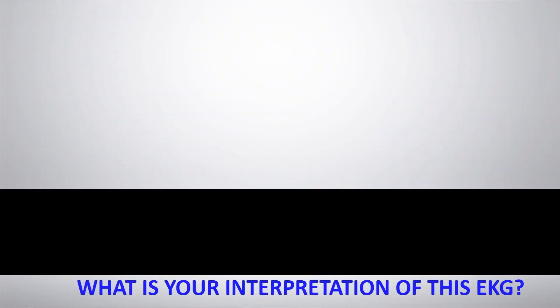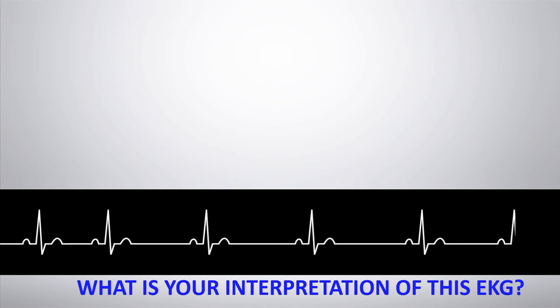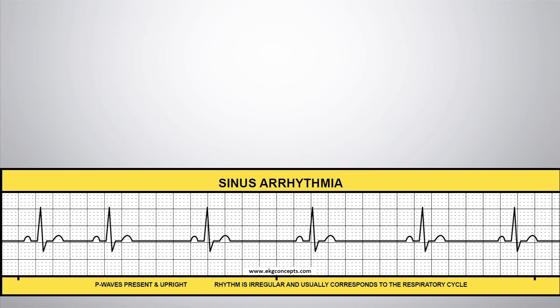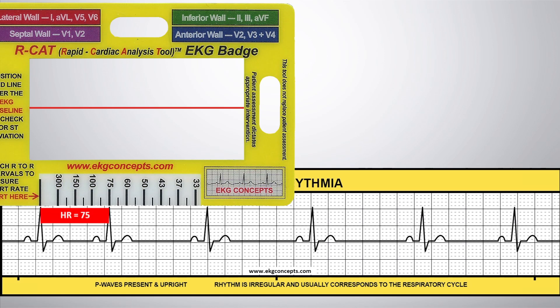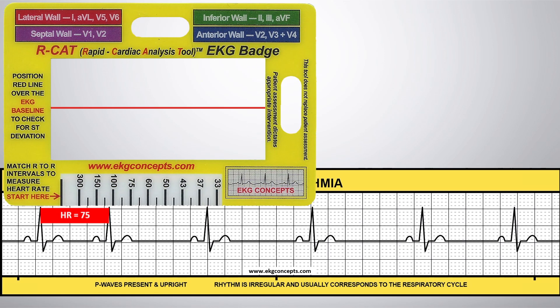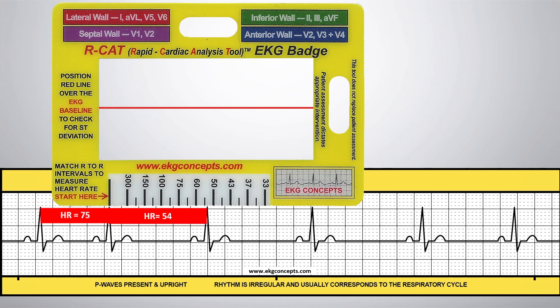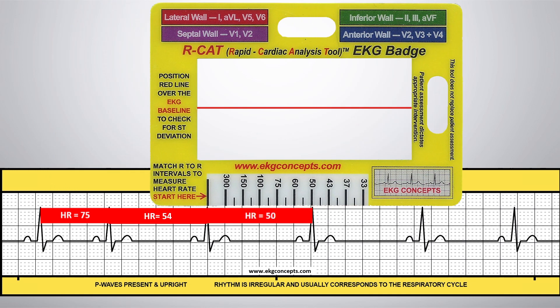What is your interpretation of this EKG rhythm strip? Sinus arrhythmia. Using the EKG badge to accurately and quickly confirm, match the R to R intervals to measure the heart rate. The heart rate is irregular.